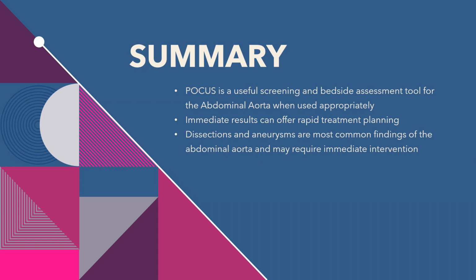Well, this was a rather brief discussion on abdominal aorta and the common pathology here. If you have any questions, please let me know. We know that POCUS is a useful screening and bedside assessment tool for the abdominal aorta when used appropriately. It also can help plan patient treatment, whether it means to direct them for an official scan or to set them up for 6 to 12 month follow-up or get them to surgery immediately. It can be a very useful tool in that.